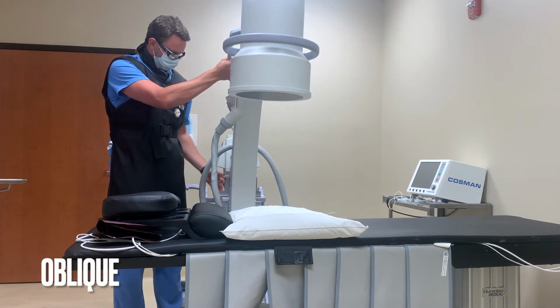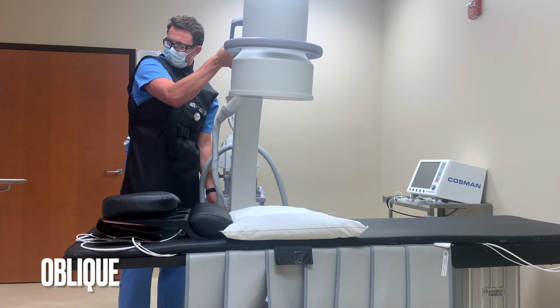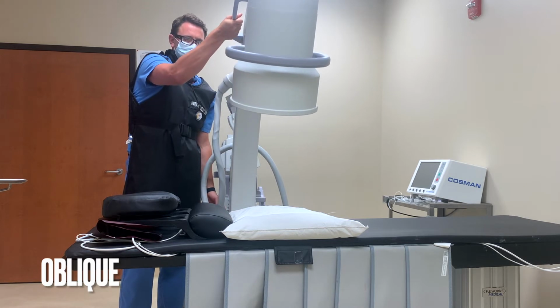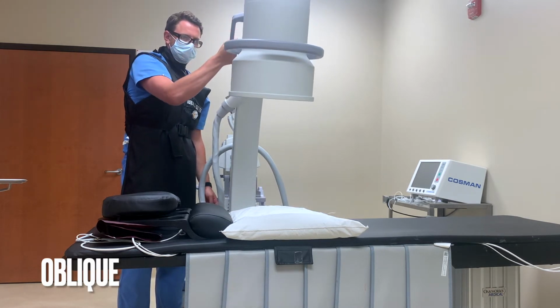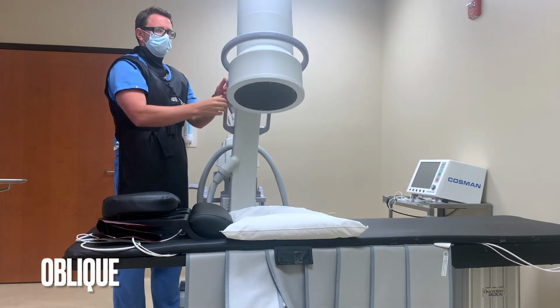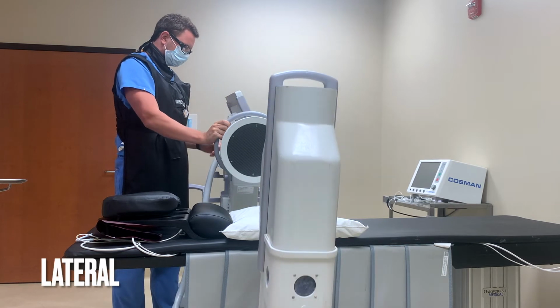We will now display the oblique movement. The C-arm will rotate circumferentially around the patient either towards or away from the physician. The lateral position refers to 90 degrees oblique.